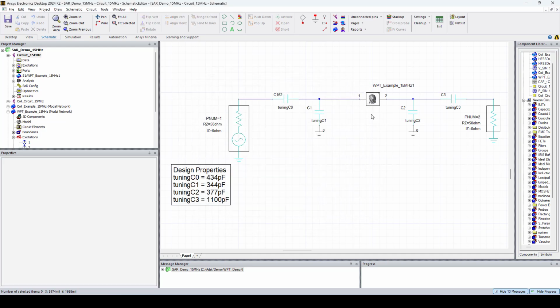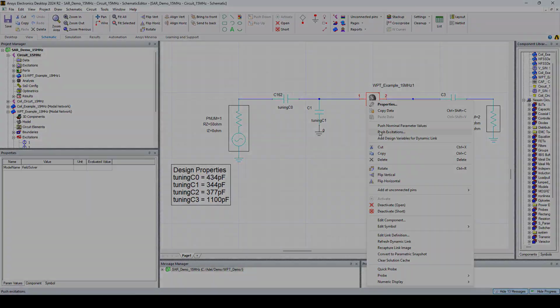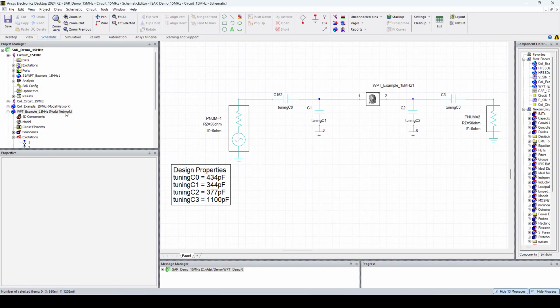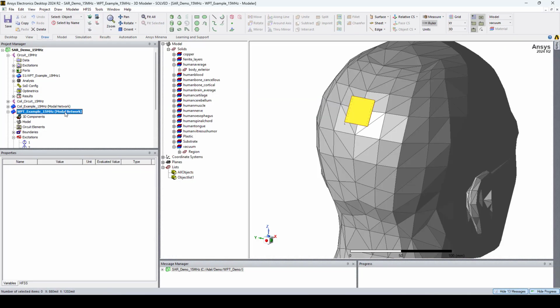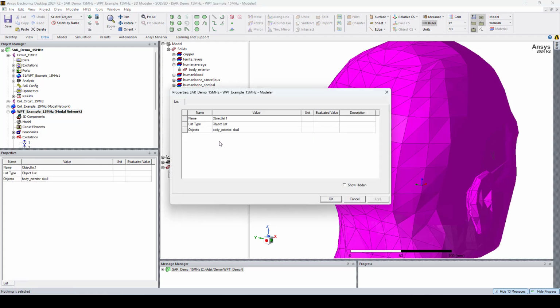And after solving the model, to push excitations, we right click on the model and click push excitations. Once the updated excitation is pushed back to HFSS, the SAR maximum value and distribution can be calculated. First, an object list is created. Here under lists, you can see object list 1 that I created, which includes the skin and the skull objects.